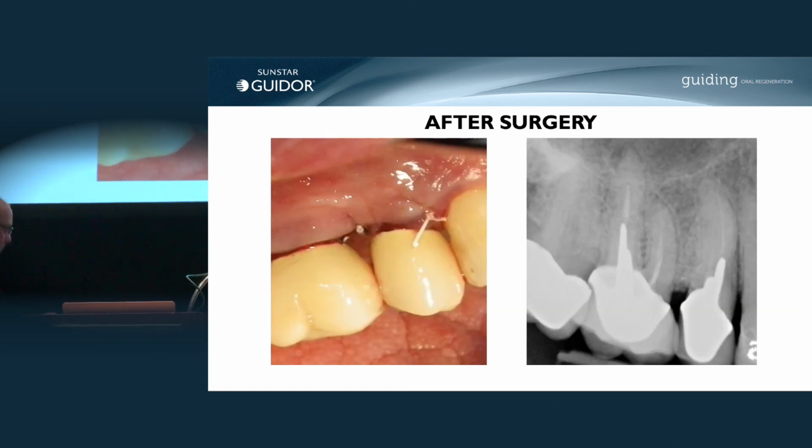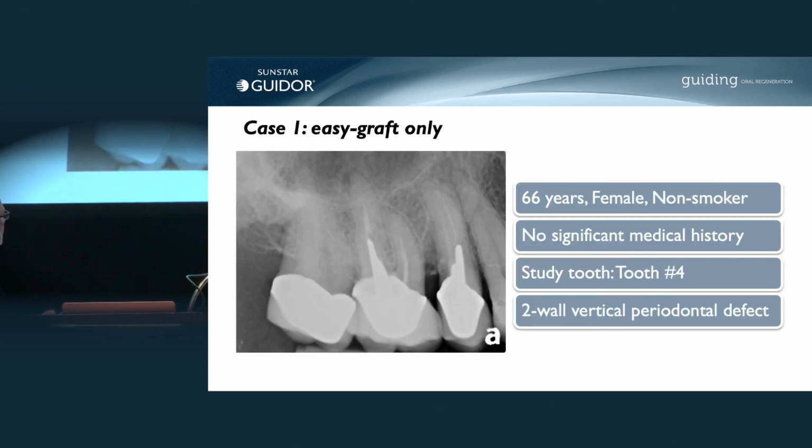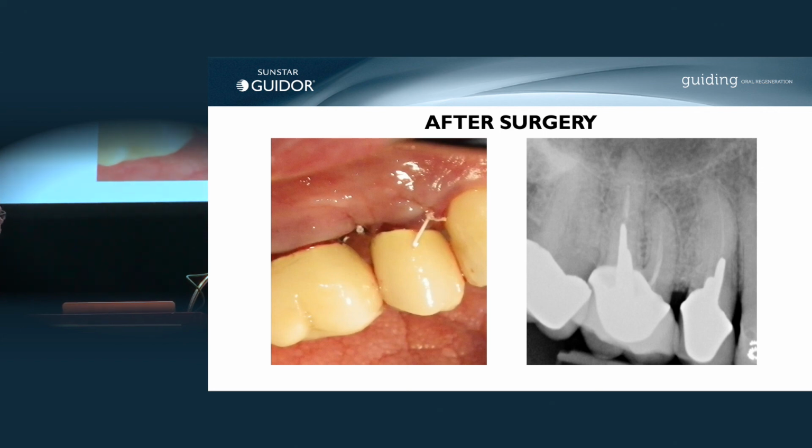The defect is really here. I know it's a little harder to see, but this is the area of the defect. The area, again, was very thoroughly degranulated. The roots of the teeth were scaled and root planed and debrided, and Prevgel was used to condition the roots. And here is easy-graft placed in the area. Again, no membrane in this case.